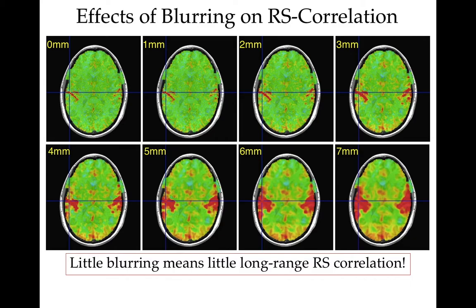This is what people look for in resting state. They look for long-distance similarities in maps. There's no task in this study. The person just lies in the metal tube and thinks whatever thoughts they think. And then we look for parts of the brain that were going up and down in synchrony.